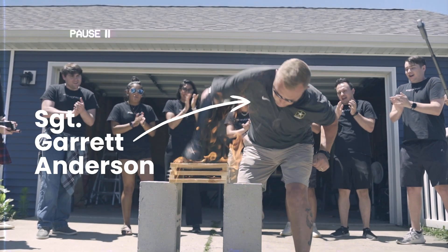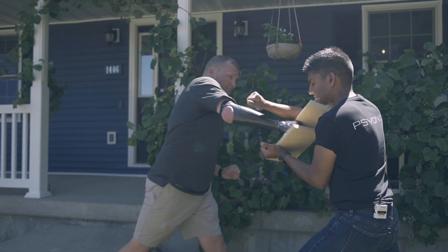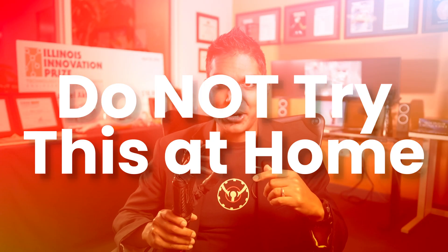This is retired Army Sergeant Garrett Anderson, and this is his bionic hand. Today, we're chopping, dropping, and shocking this hand to see just how durable a modern bionic hand can be. So for these stunts, don't try this at home.